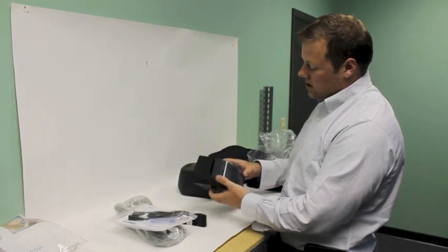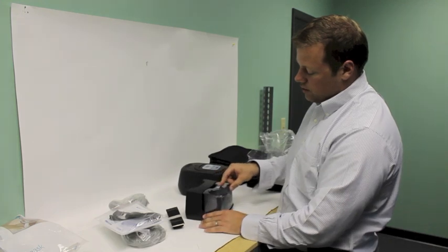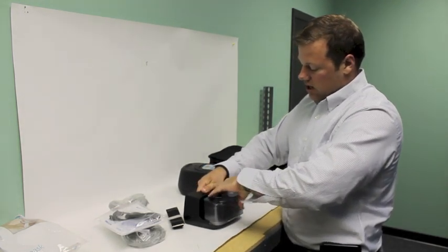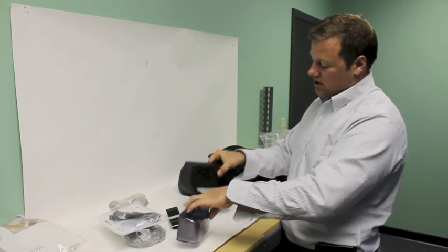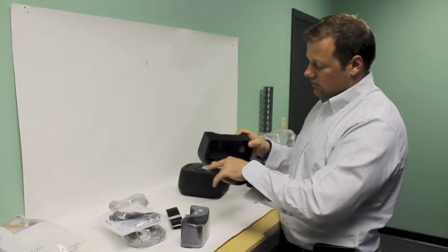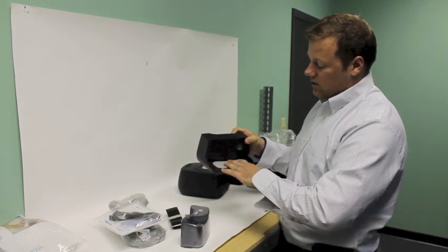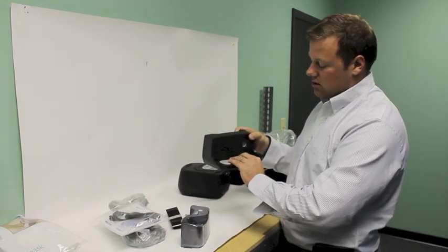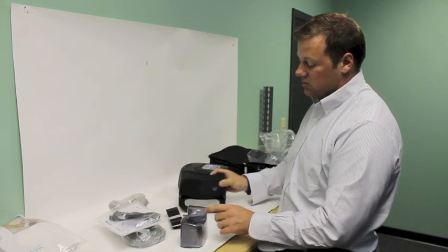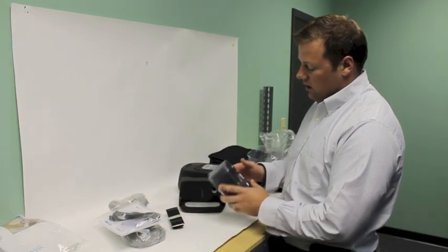If you wanted to take the humidifier, or the actual water chamber, off, you have to press down and pull out. The reasoning for it is that this heating plate right here is spring loaded, and you have little grooves on either side to guide it right back in. So this has to be compressed in order for the humidifier to work, to start warming up this air, because it has this same metal plate right there.